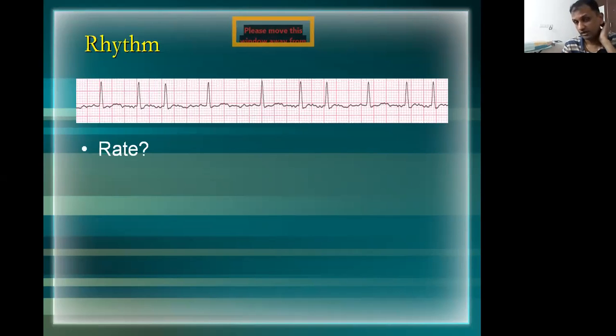Next, if you get a patient with atrial fibrillation, you need to know the heart rate, because there's something called fast AF and slow AF. To know that, you use the calculation which I mentioned earlier: calculate the number of complexes between two RR intervals. But this is going to be difficult. If you calculate between this gap, the rate will be different to if you calculate this one. So what people tend to do is calculate the average distance for 10 complexes, like 1, 2, 3, 4, and they mark it on a white paper and calculate the average.